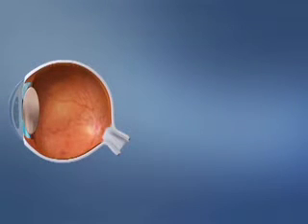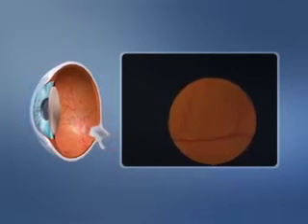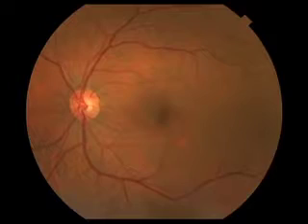Think of the pupil as a window through which you can view the inner structures of the eye. The light rays from the ophthalmoscope pass through the cornea, pupil, and lens to focus on the retina, producing an upright, magnified image. The retina is located on the inner surface of the globe, opposite the pupillary opening. The color should appear red, orange, or brown, and varies from person to person.